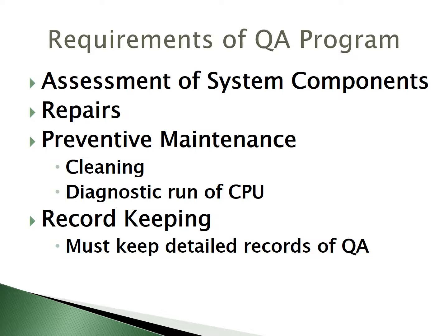Another thing that we can do through preventative maintenance is to run a diagnostic on the computer component of the ultrasound machine. As computers run into errors during their operation, they'll create a log of this, and running a diagnostic on that can bring up those errors that maybe somebody didn't catch or wasn't aware of. So then we can look into it: is this going to affect how the machine is working?